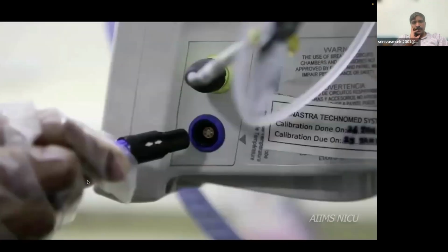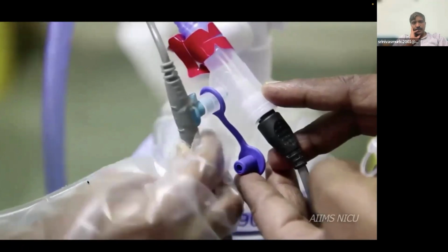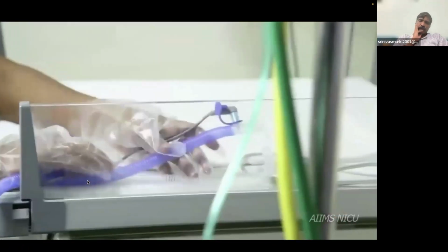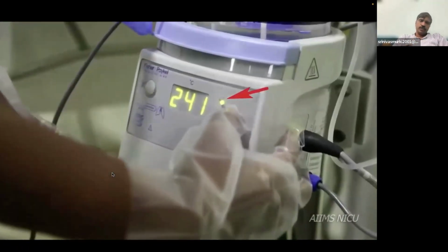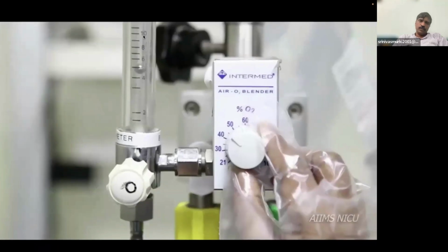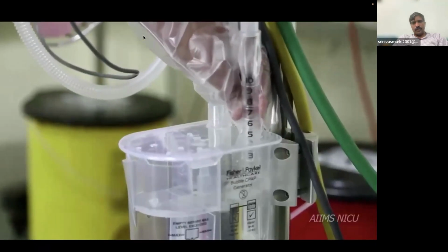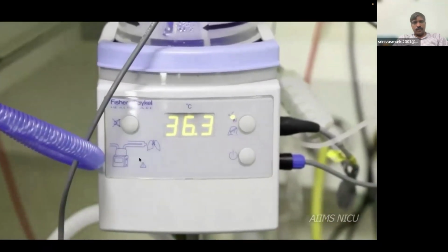Fix the heater wire and the temperature probe to the appropriate slots available in the humidifier and the inspiratory limb of the bubble CPAP circuit. Switch on the humidifier and set in invasive mode as shown here. Watch for bubbling in the bubble chamber. Set the FiO2, flow and pressure to appropriate level. Wait for the humidifier to display a temperature of 37 before connecting the circuit to the patient.